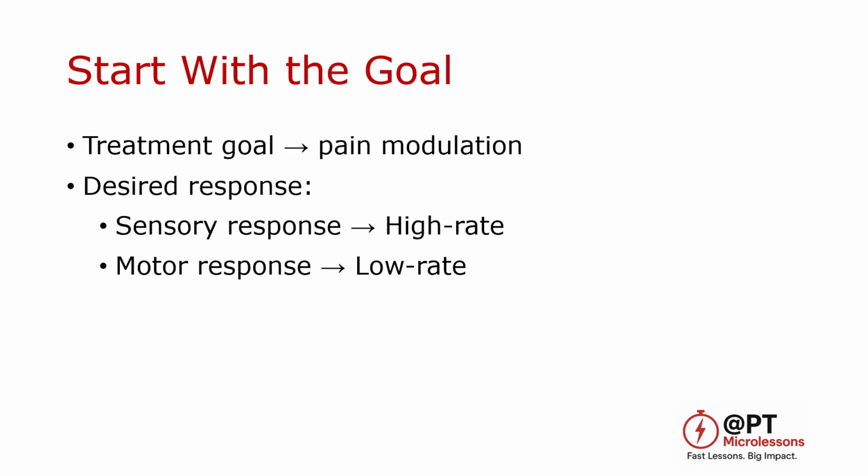As clinicians, we begin with the treatment goal. In this case, the goal is pain modulation. Next, we decide on the type of response we want to produce. Do we want a sensory-only response, or do we want a sensory and motor response? This decision will guide the settings we choose.